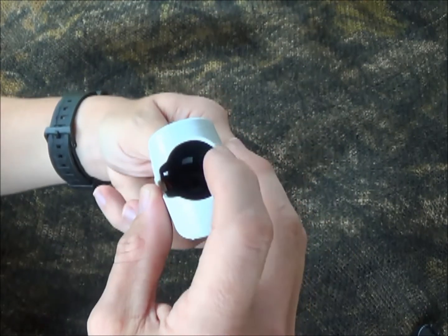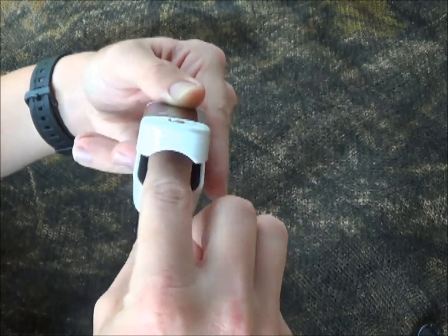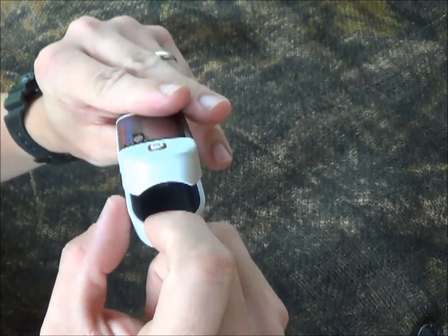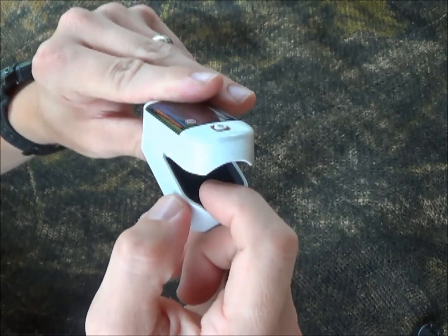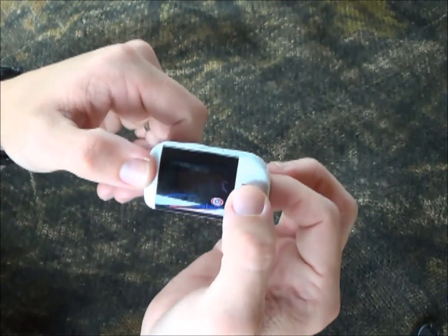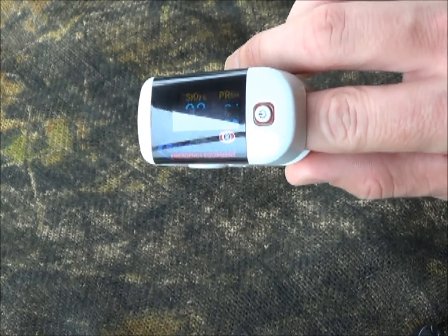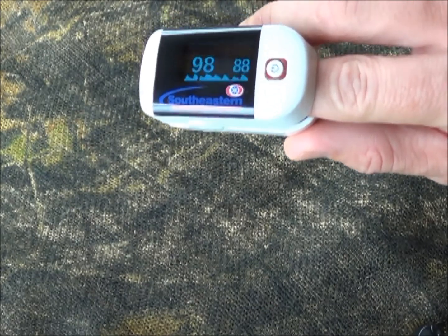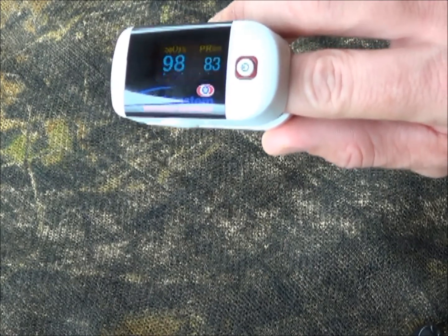In simple terms, it has two beams of light that come out one side, go through your finger, and are measured on the other side of your finger, given out as a percentage. Now, between 95 and 100%, O2 saturation is completely normal for the average patient. You can see that mine is 98% right now and my pulse is close to 88-90 beats per minute.